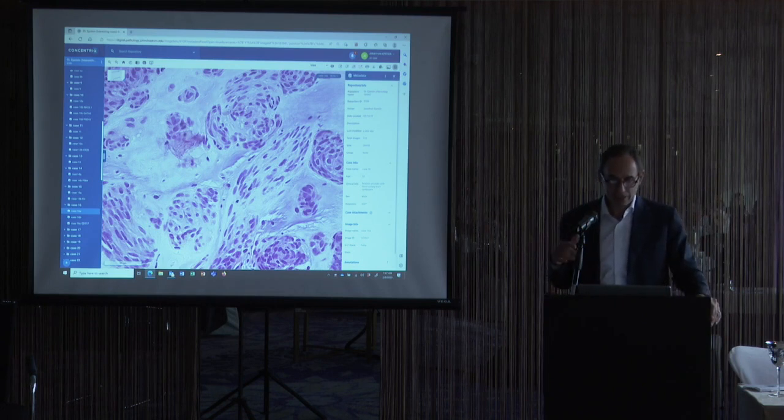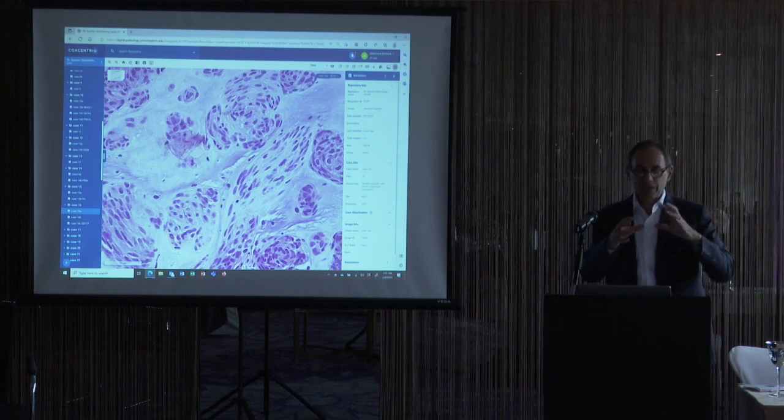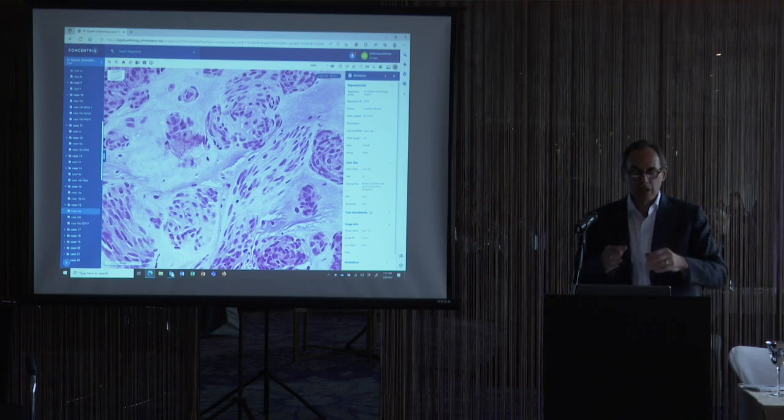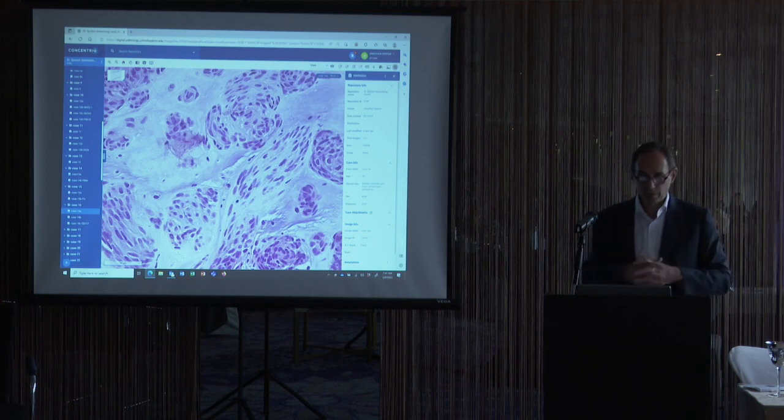We did a study of this a while ago, and the way they manifest, you can get a large GIST arising either from the rectal muscle wall, or even the mesorectum between the prostate and the rectum. And that GIST can be so large that it actually compresses the prostate almost like a pancake. On imaging, they will think it's a prostate tumor nodule, as opposed to a periprostatic nodule.